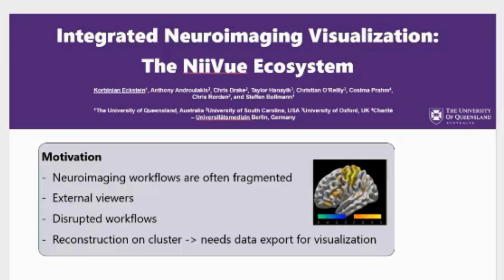On the bottom right, you have native apps. For iOS, iPad, and macOS, we created a unified app, and also for desktop for Apple, Linux, and Windows, there's an app. And on the bottom left, there are developer libraries. We have NiiVue with Jupyter notebook support, and NiiVue JL, which is for the Julia language. And what you can do with these is you can create interactive dashboards in Jupyter notebook environments.